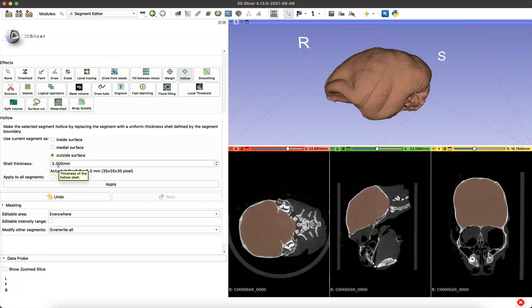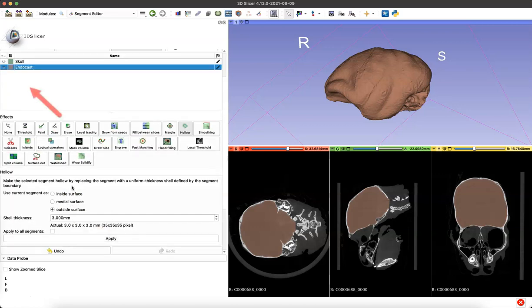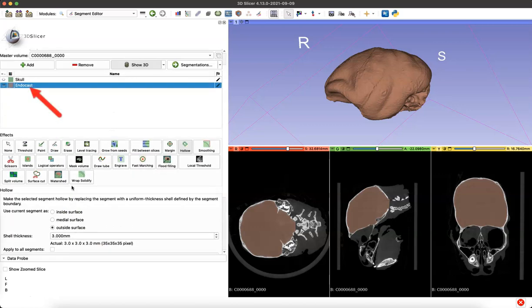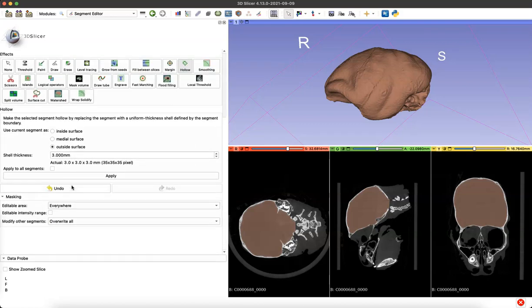We can adjust the shell thickness down below and it defaults to 3, which we'll just leave it at that for now. We want to make sure that we've selected endocast and we're not on the skull model and simply click apply.